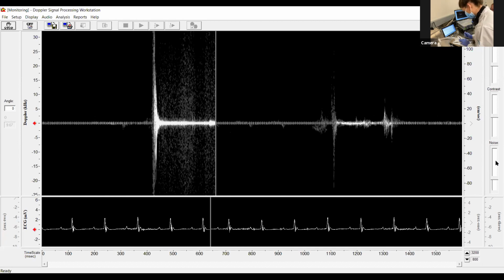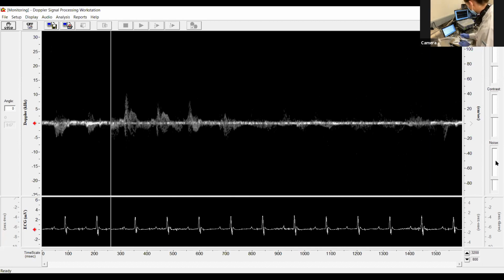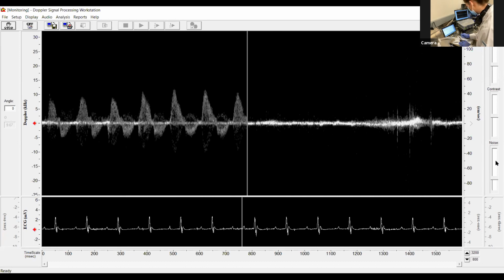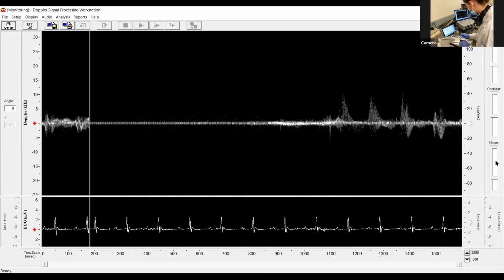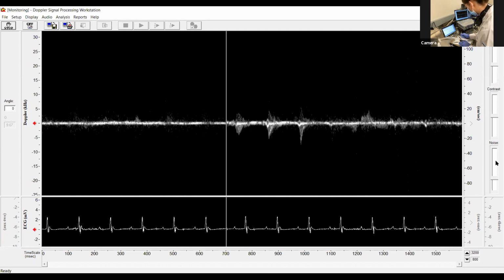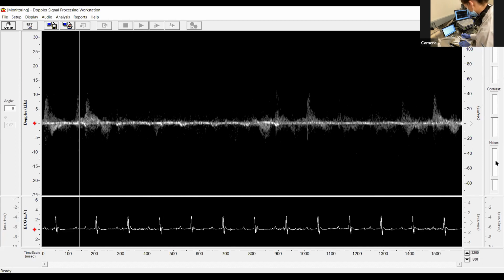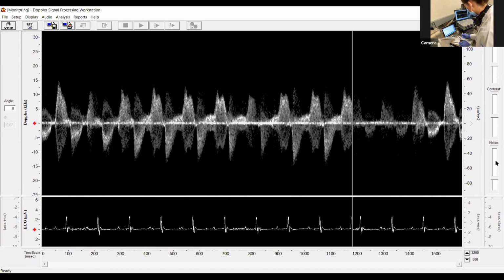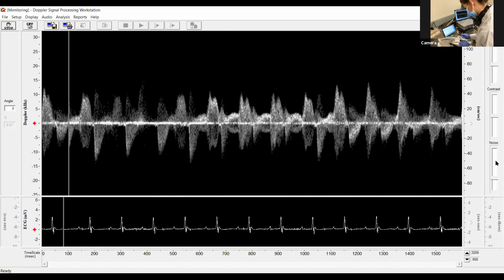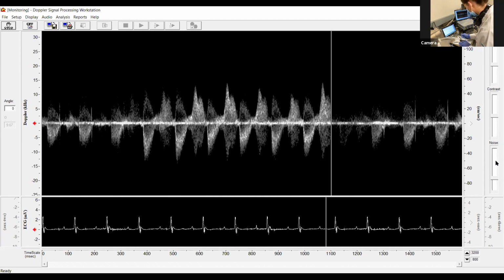Sydney's going to just take a different approach and come from the top, where we saw it when we were doing the coronary. She actually saw a really nice mitral signal, which is coming in here as well. So again, these mice, their hearts are apparently not in the regular position that we're used to seeing. So we're getting quite a nice mitral signal there.